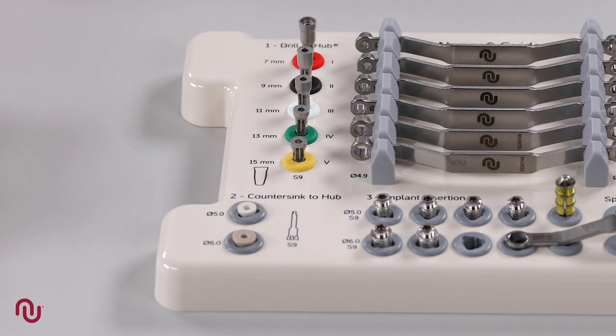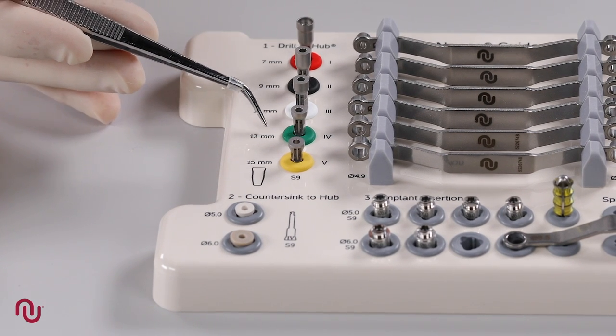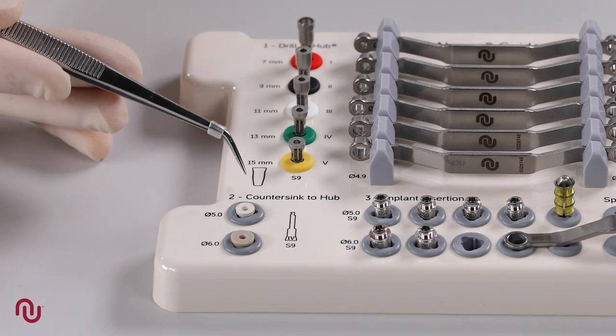If countersinking, then we always use Drill Hub 4, green, together with the countersink conduit.